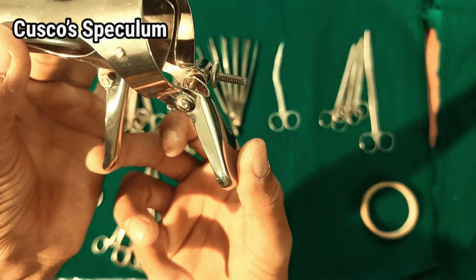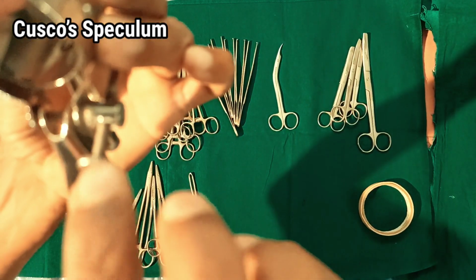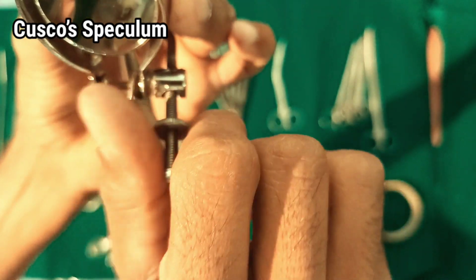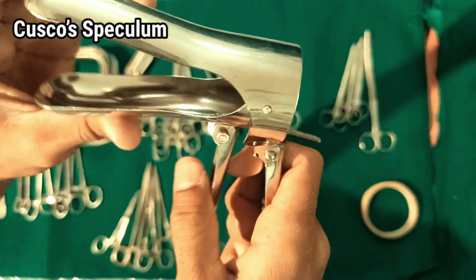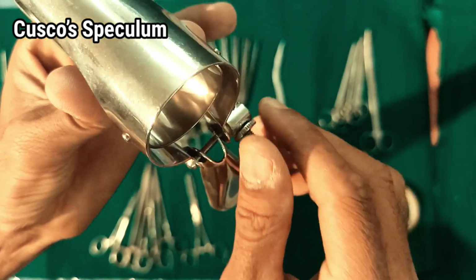It is preferred in cryosurgery because it protects the anterior and posterior vaginal wall. The advantage of Cusco speculum is that it is self-retaining. Therefore, an assistant is not needed to keep the speculum in place. It also acts as a vaginal wall retractor.